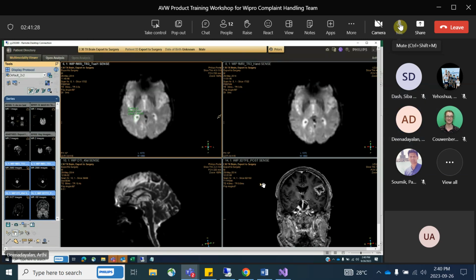Okay, any other questions in MMV? Any other doubts, questions? I have just told the gist of MMV because it's a huge thing. There are so many things to be discussed, but these are the basic things. Once you log in, what you have to see and perform hands-on, I think this should be enough for you all. So any doubts so far?